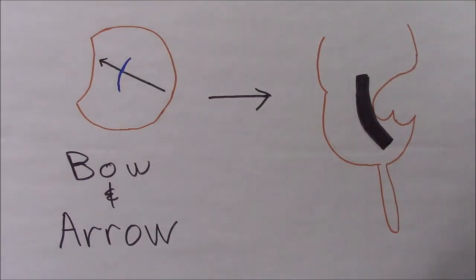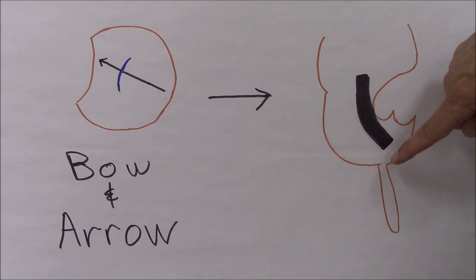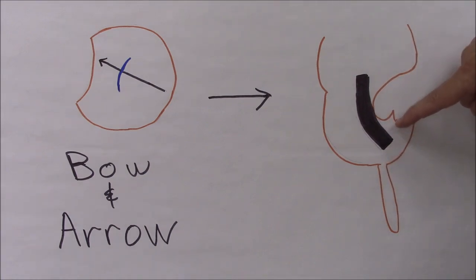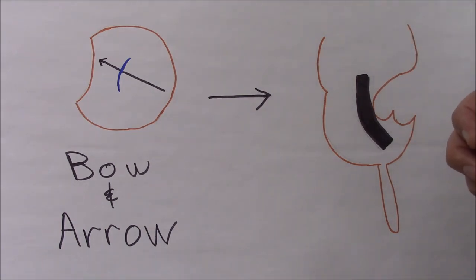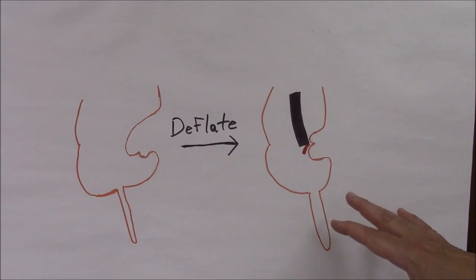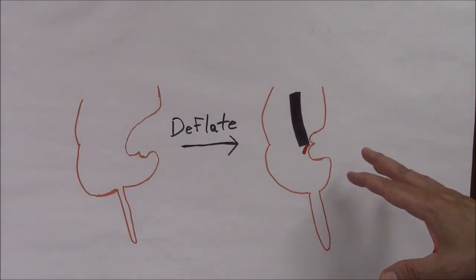The problem with this on a routine basis is that you spend a lot of time distal to the valve, slowly coming back. So this is okay in a difficult situation, but it's not as efficient for routine use as the simple method of just deflating a bit, looking, finding the crevice between the valve lips, and driving straight into the TI. That should be tried first in almost every instance.